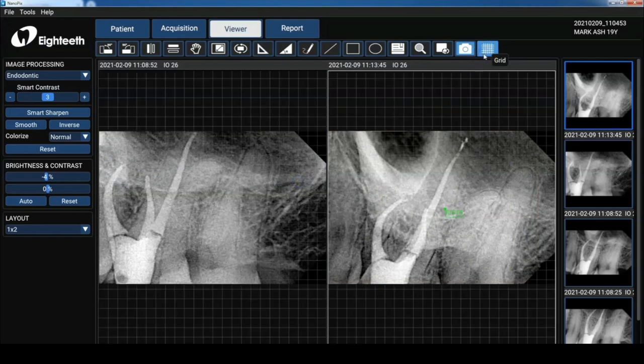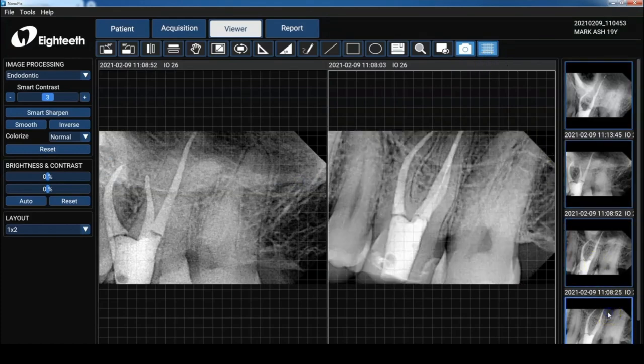Don't forget, you can any of the images in the panel on the right, you can double click and up they come.